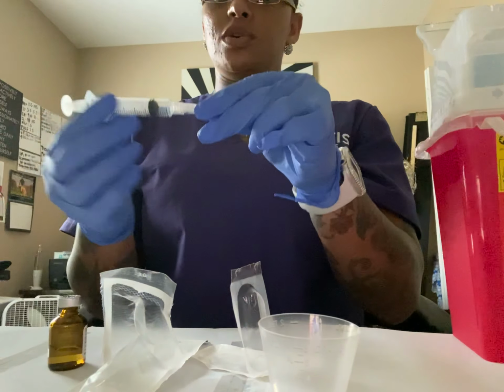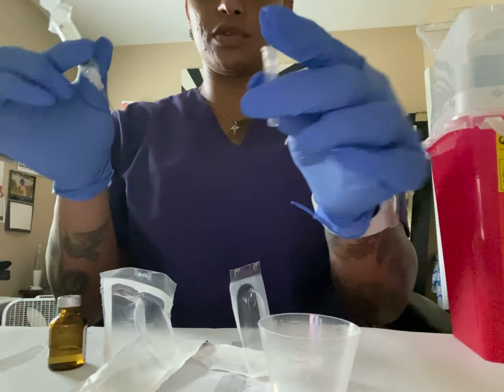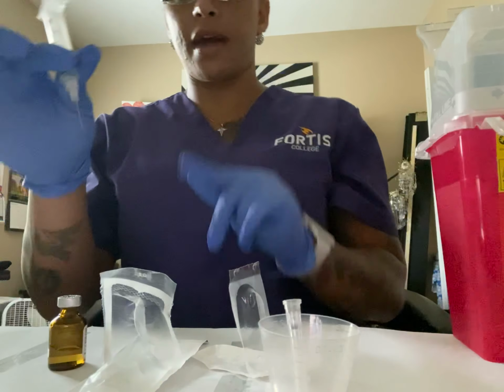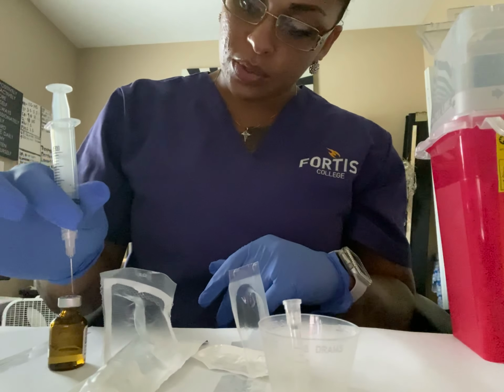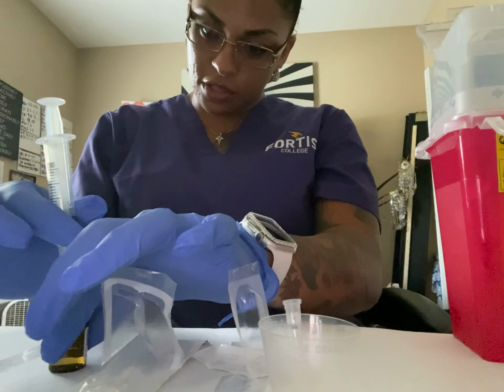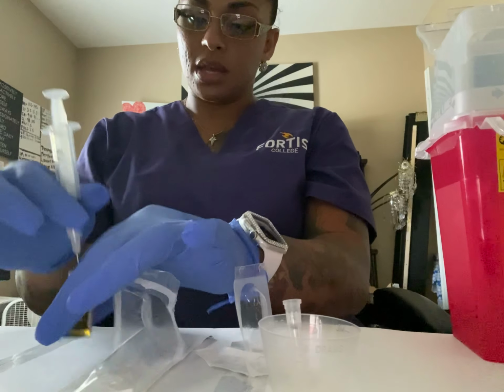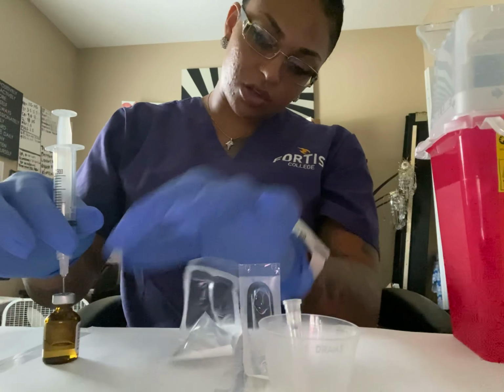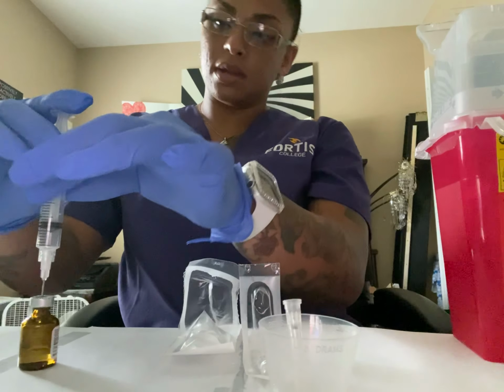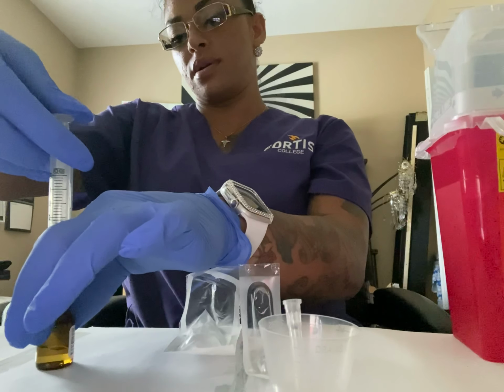So what we're going to do is remove the cap of the syringe and place it in this medicine cup here. Okay, I'm going to inject the needle into the vial right above the solution, not into the solution. You want to make sure that it is always at eye level. I'm going to use the plunger and inject the air.